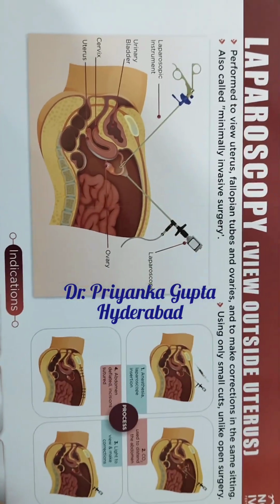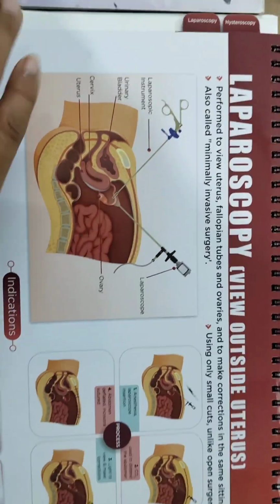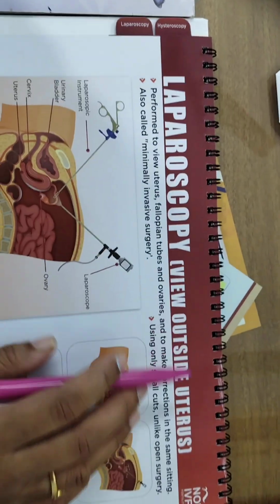Hello everyone. So today I'm going to discuss a video which is in continuation with the previous video. In the previous video we had a discussion on hysteroscopy, that is a view inside the uterus. Now today's is going to be the laparoscopy, that is view outside the uterus.